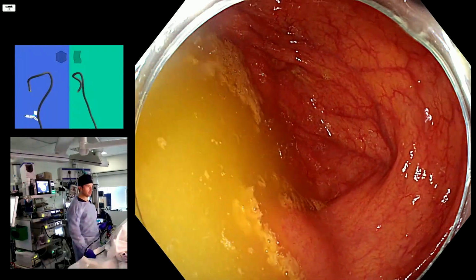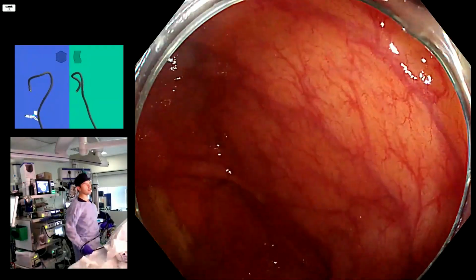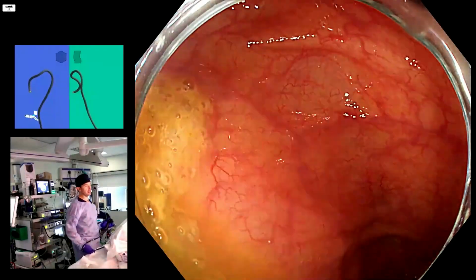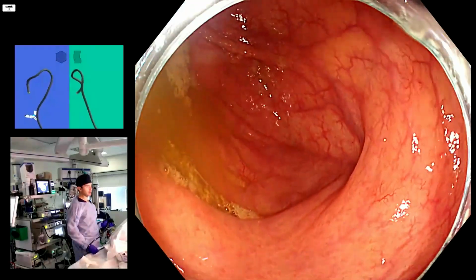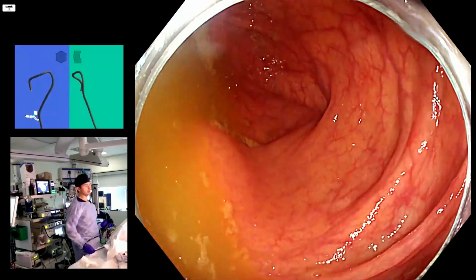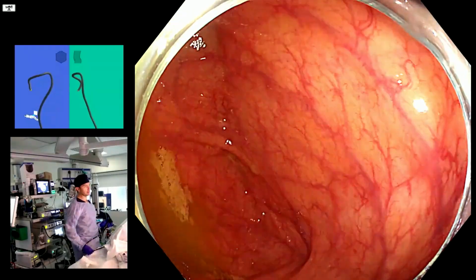The videos we're making for GIEQs VI. We're talking about colonoscopy quality here. One serious quality indicator that we want to get over in the next few years is mucosal visualization. And of course, we are eagle-eyed people watching the scope tracking might think to say that we are just in the ascending colon, just past the hepatic flexure, and we have all this fluid pooling, the caecum is totally collapsed.